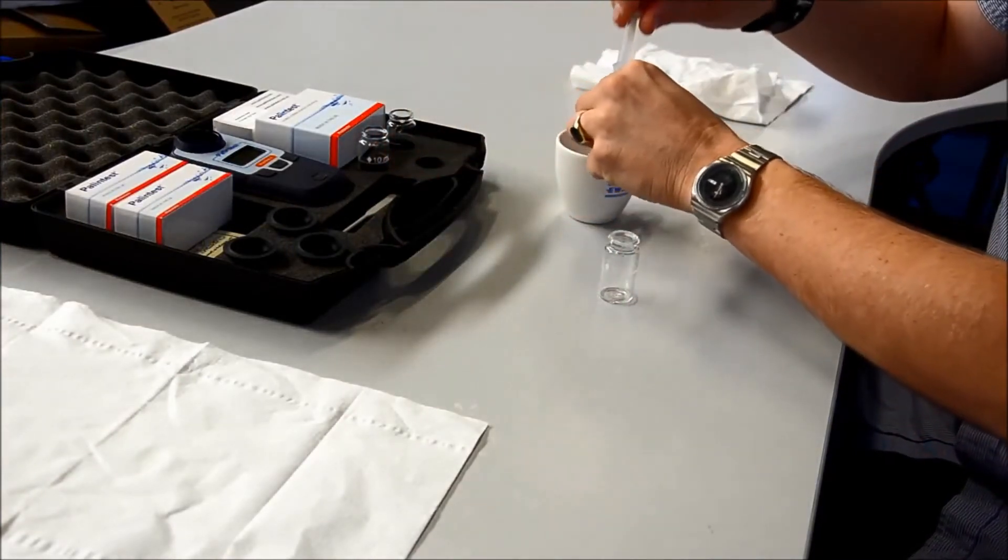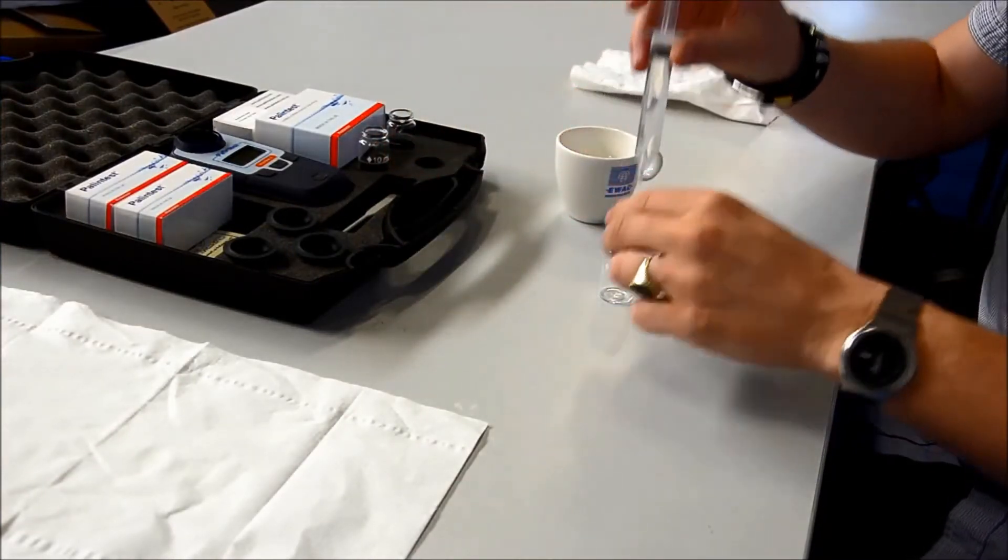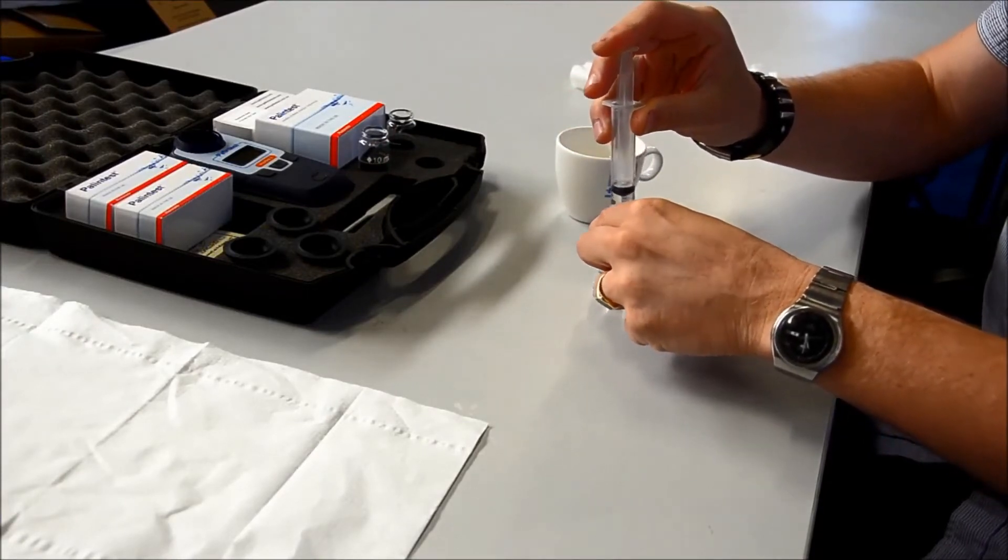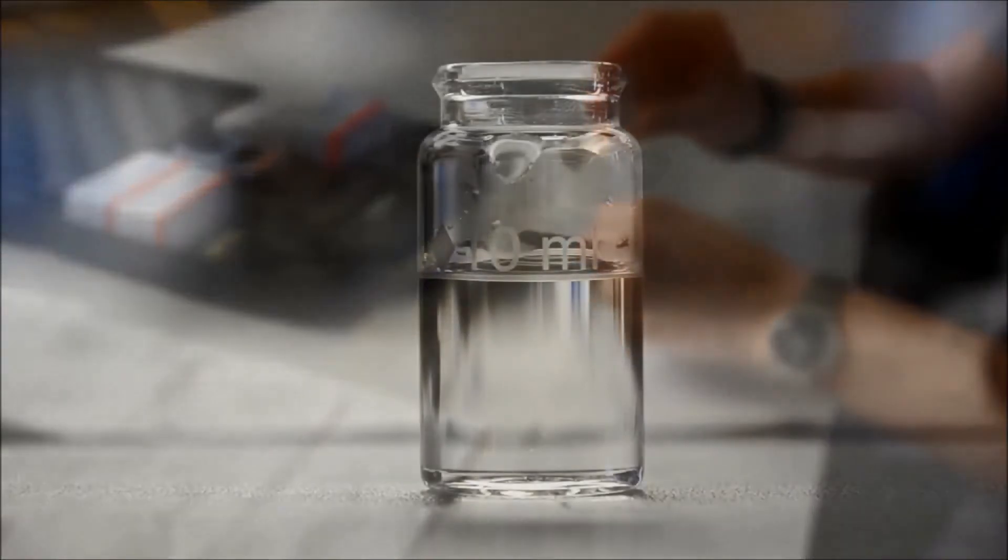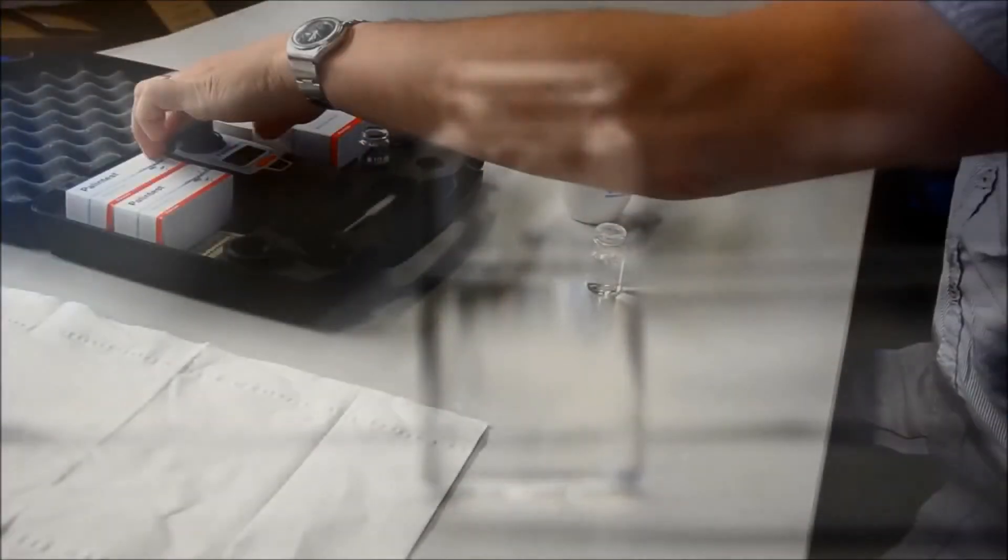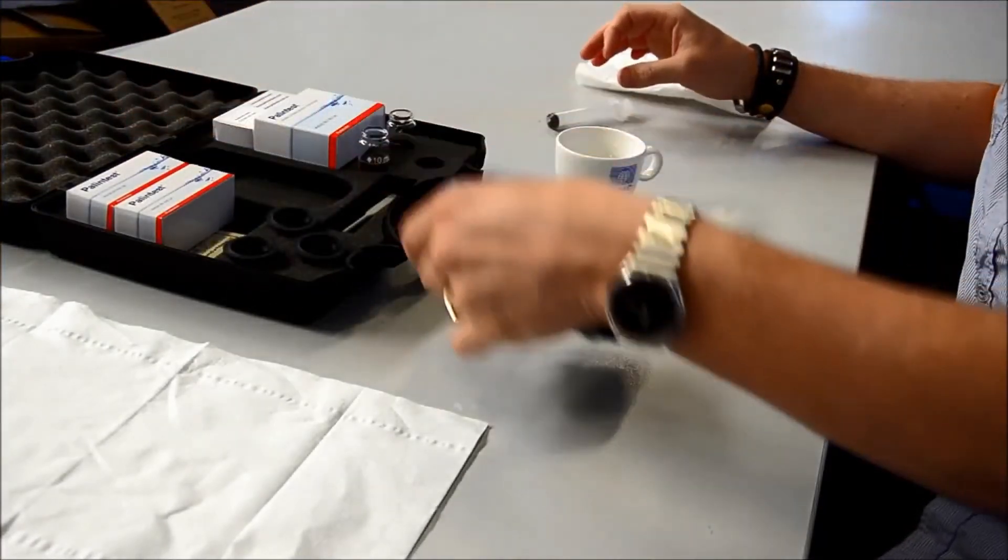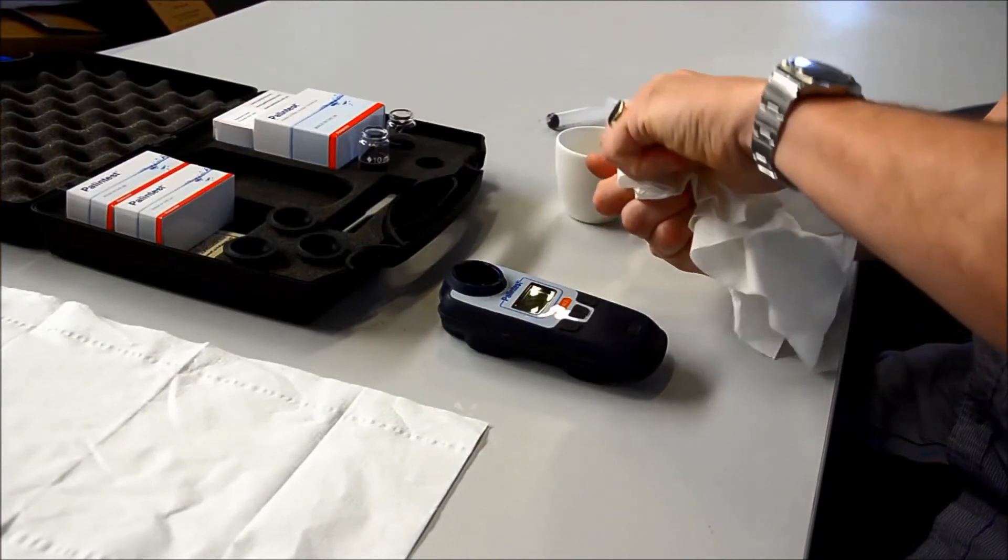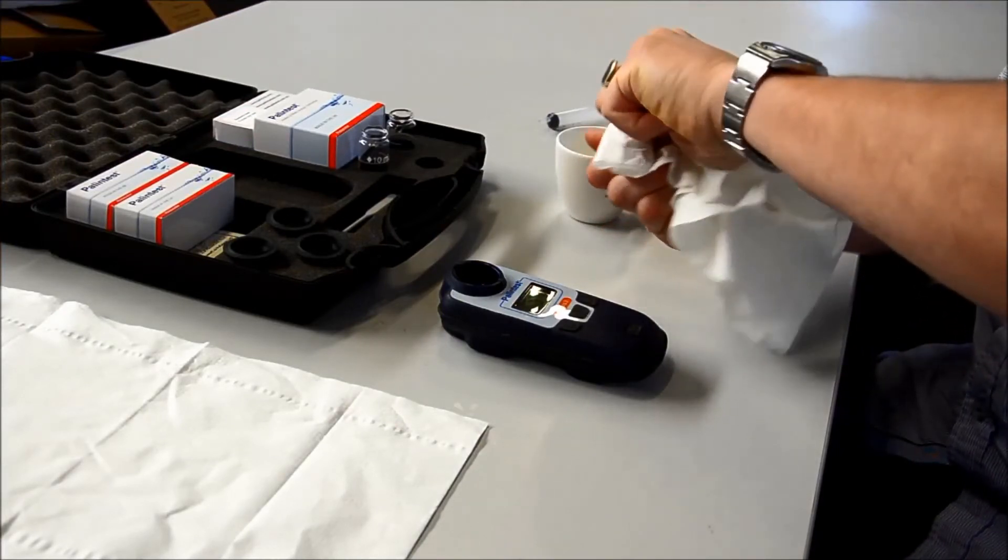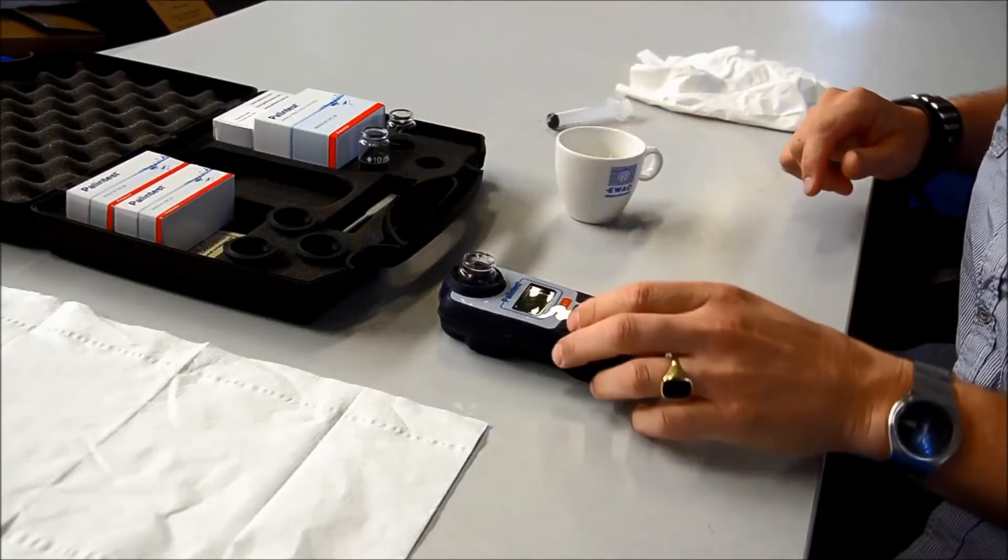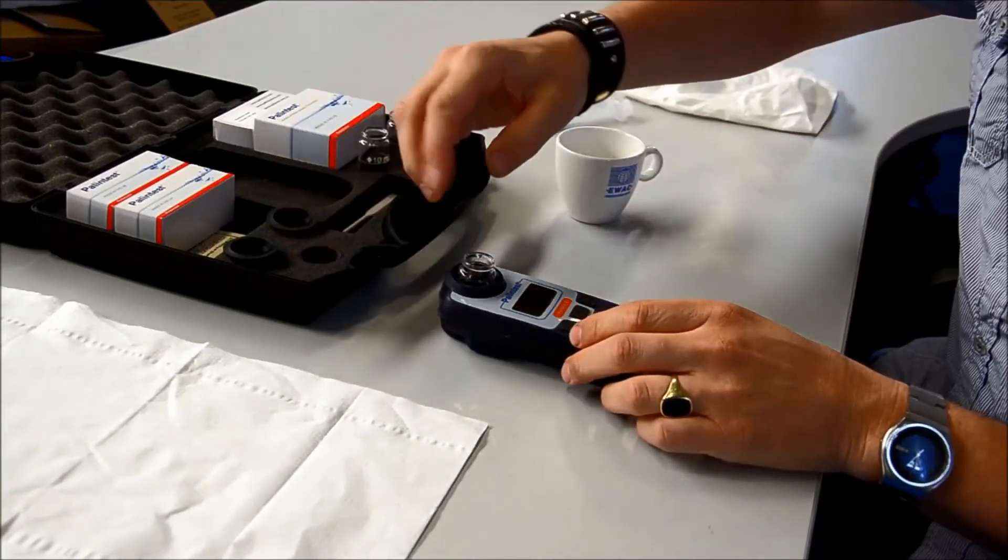Use a syringe to take water from the coffee cup and then pour exactly 10 milliliters of water into the glass cuvette. As you can see here the lowest line of the water level should match exactly with the line on the glass. To make sure there's no fingerprints on the outside we clean the outside of the cuvette before placing it into the measurement unit. Then we place the black rubber cap.